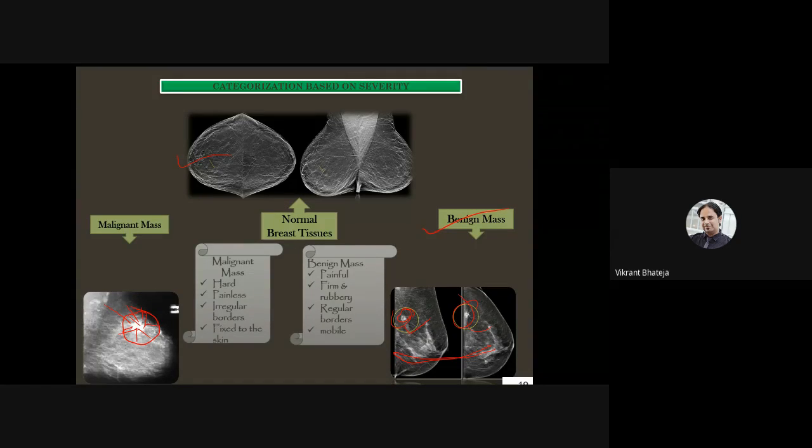So this is how a radiologist differentiates between a malignant tumor region and a non-malignant tumor region. From the image processing point of view, it is very important that the contrast of the tumorous region should be very well balanced so that you can visualize these tumors. The sharpness of the tumorous region should be very good, because once the sharpness is good, then it is practically possible to visualize those edges.